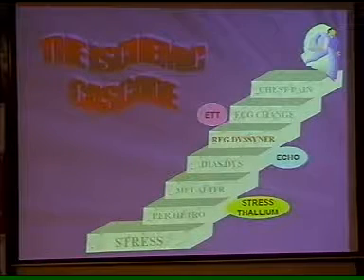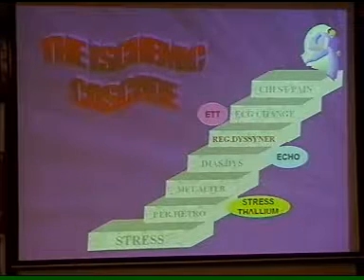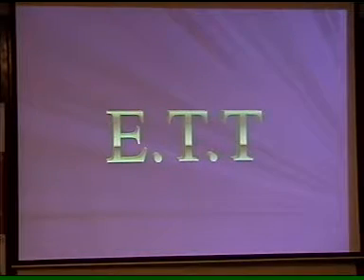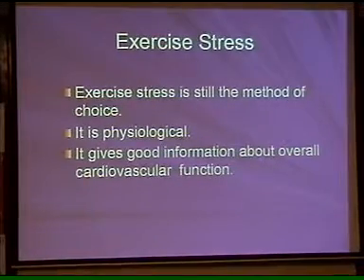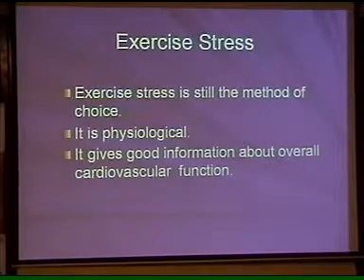My lecture is basically to give you an idea to prescribe the test and to interpret the reports. I'm not going into the details as you are not going to be the performer. Now, the first thing we are taking up is ETT. Obviously, ETT is physiological, it's a method of choice, easily performed.